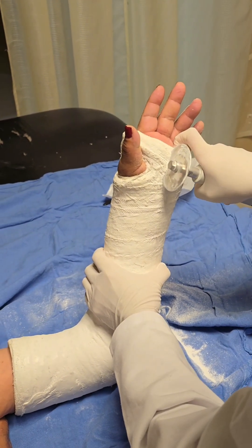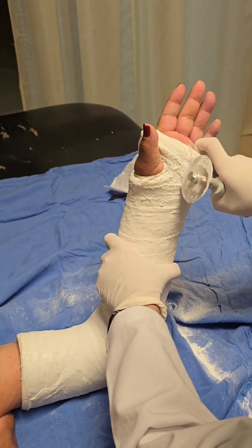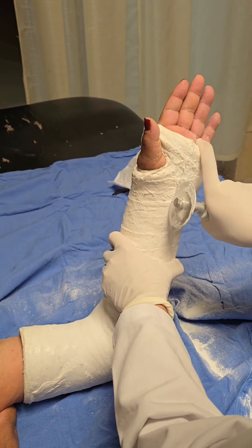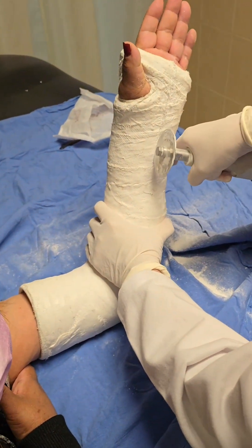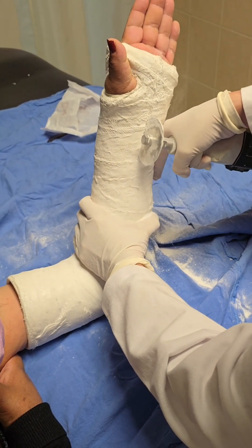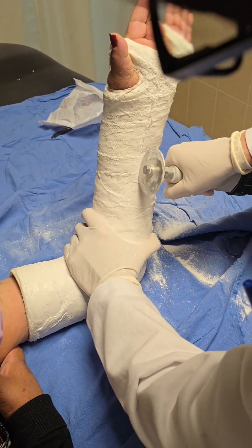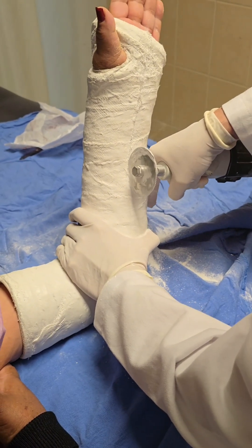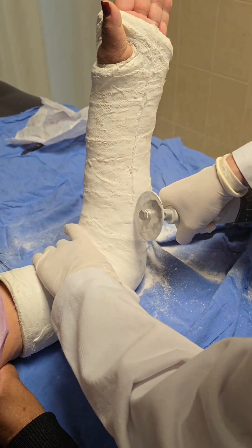Myth two: skin safety. Many people fear that the cast saw will cut their skin, but here's the truth — the saw is specifically designed to be safe for your skin. It cuts through the hard plaster or fiberglass of the cast while gliding over the softer, more flexible skin. When handled by a professional, there's no need to worry. Myth three: the noise factor. Yes, the saw is loud, but the noise is just part of how it operates and has nothing to do with safety. It's all about getting through that tough outer shell without harming you.